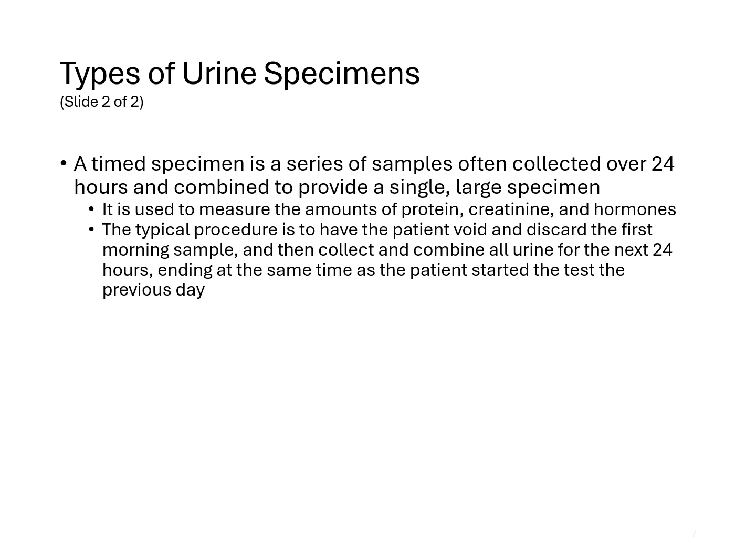So depending on your facility, they would have handouts for patients and instructions for them and you to go over to make sure that it is collected appropriately.